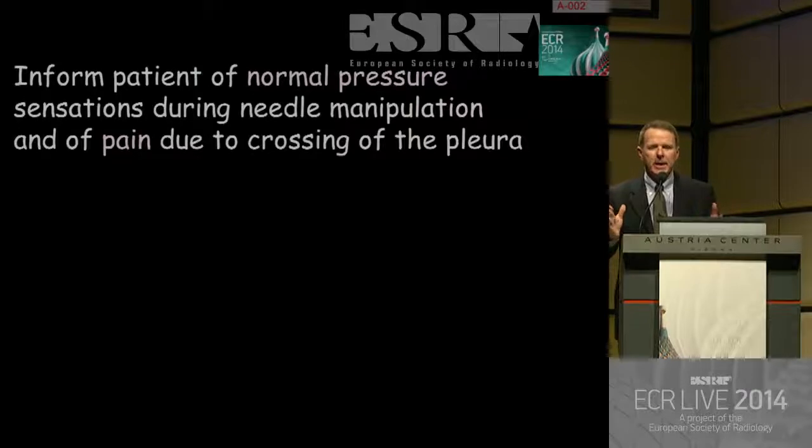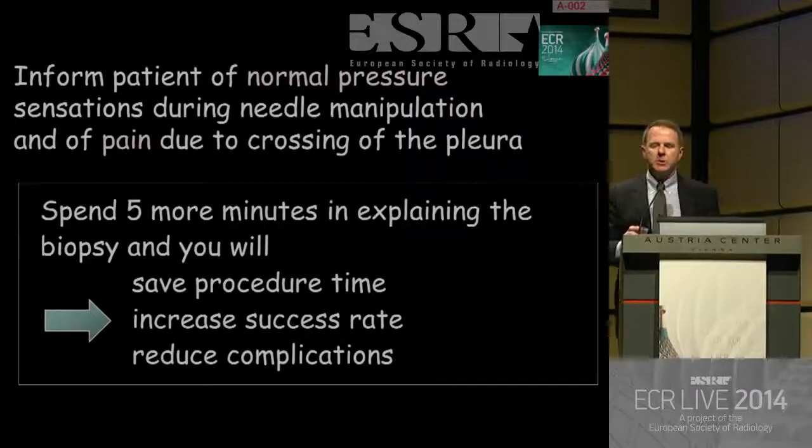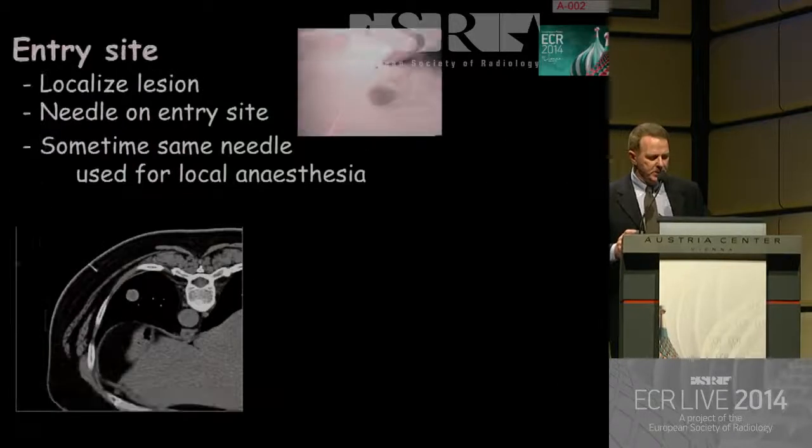Warn them. Okay? Let's say that you are in the dark ground. Somebody hits you. Okay? You're shocked. But if somebody tells you, I'm going to hit you, you're ready. You know what you're expecting. So altogether, spend 5 more minutes in explaining the biopsy, and you will save procedure time, you will increase your success rate, and you will reduce the complications.